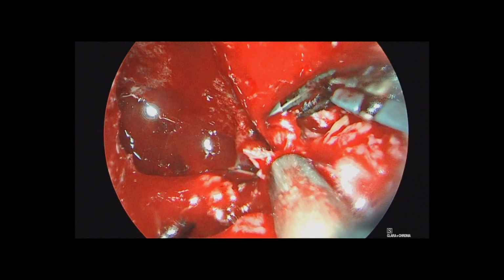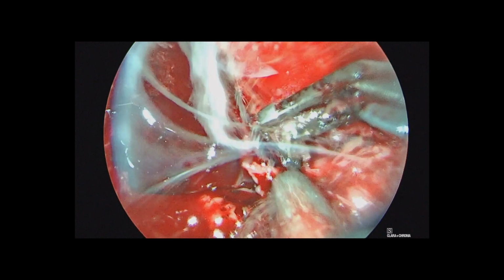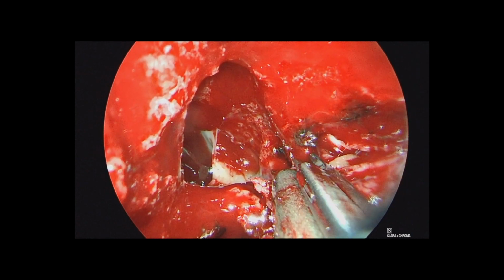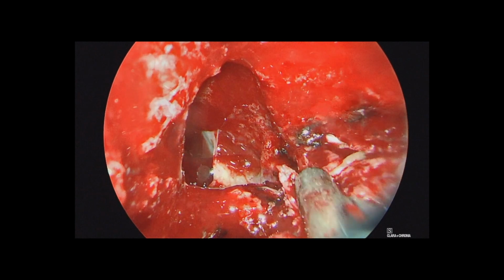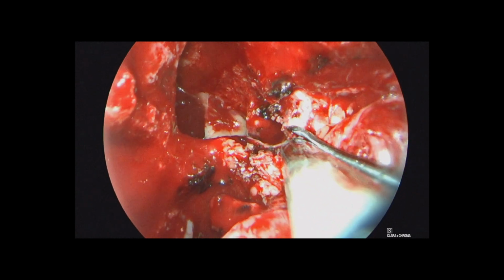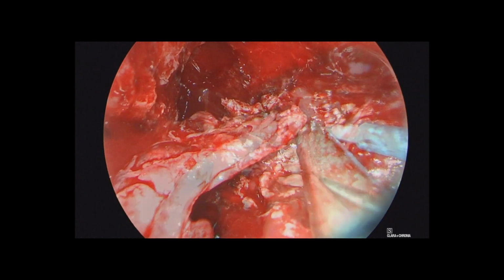And as it gets into Meckel's cave here, we'll go ahead and bipolar it and transect it to remove the entirety of it from the infraorbital nerve of the soft tissue of the cheek through foramen rotundum in an en bloc fashion.